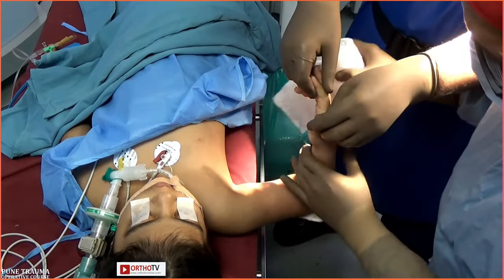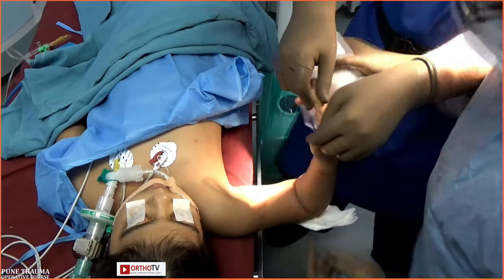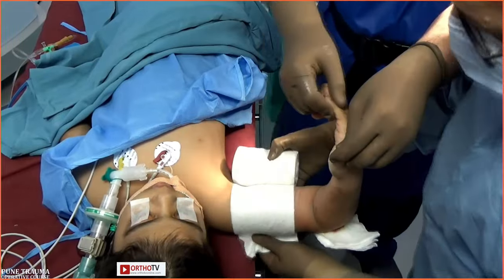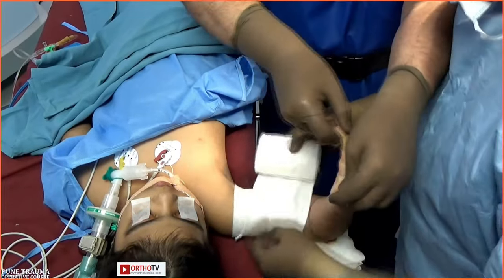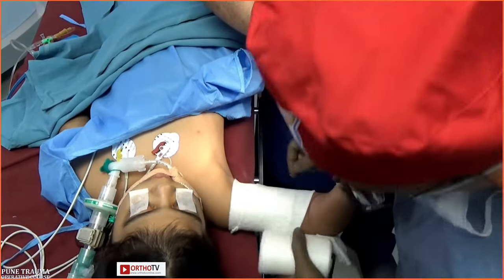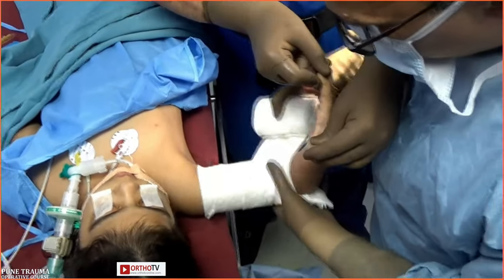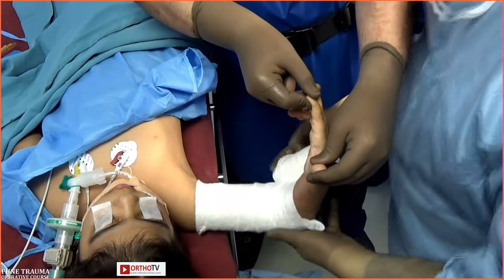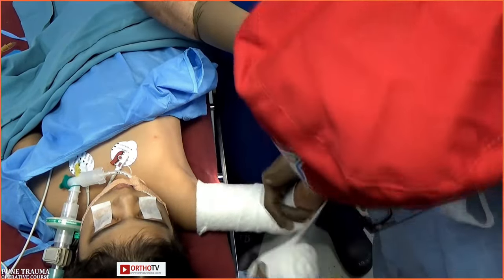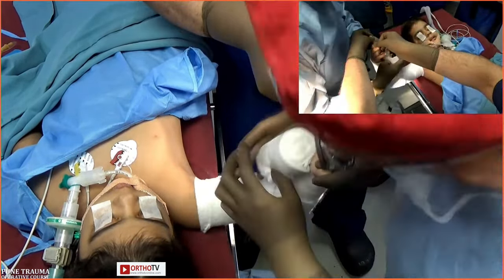We are with you. Taral, I just wanted to show everybody again, when you cast, how you put the cotton is also important. Yes, when we are doing this, we make sure that the elbow is partly extended. How much? It's about 70 degrees of flexion. Seventy degrees flexion. All right, and then I am just going around.